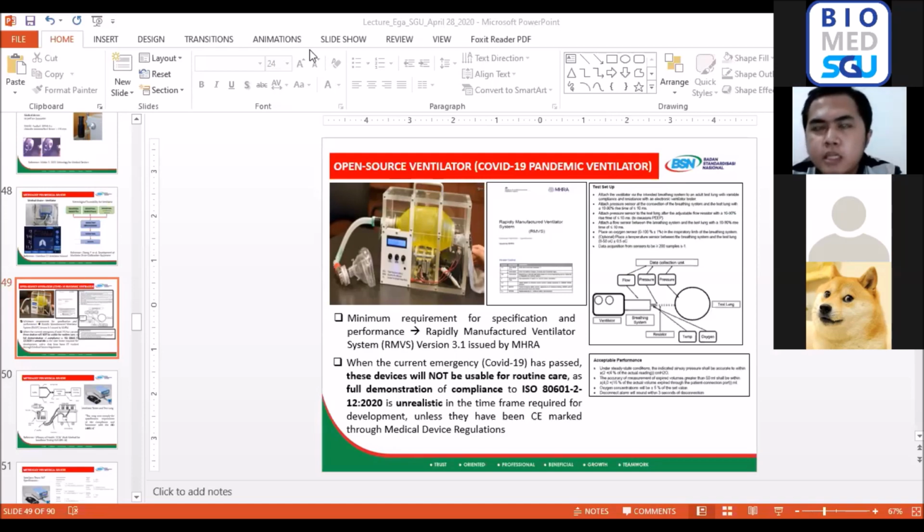When your device is labeled pass, then you can operate your device in Indonesia. I think most people know if your device has the pass label or green label, then your instrument is okay. That's the simplest way to evaluate which device is still proper to use. Of course, regular calibration is required, I mean annually.